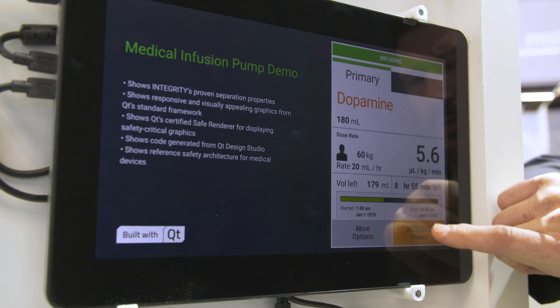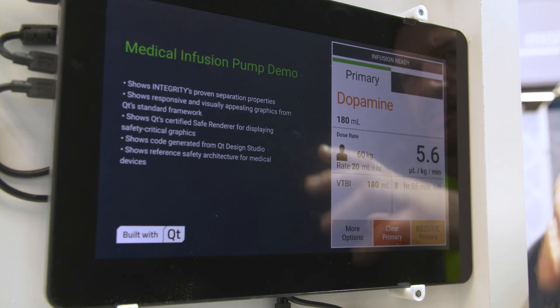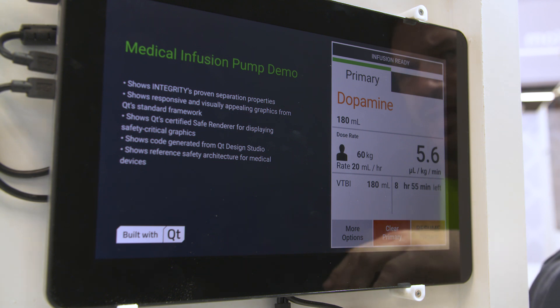What we're showing you today is a simulation of a class 3 medical device. It is built with Qt, the safety-critical information is rendered in Qt's Safe Renderer, it is built on top of the Integrity real-time operating system, and it is designed with Qt Design Studio.